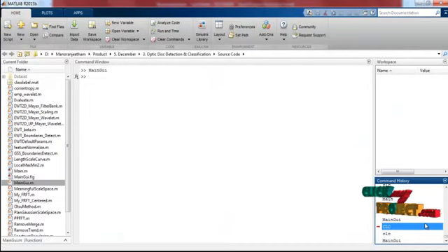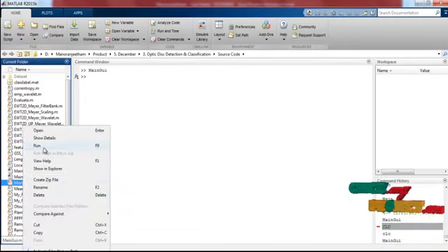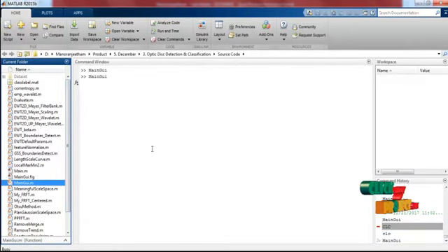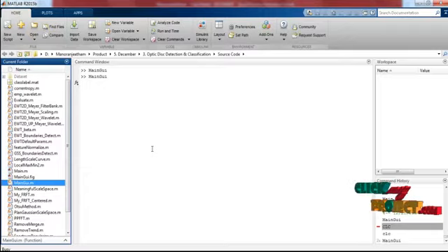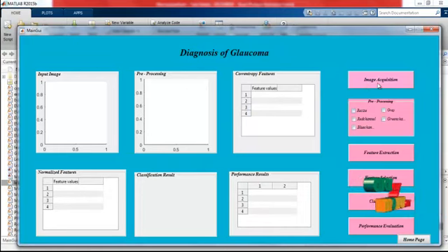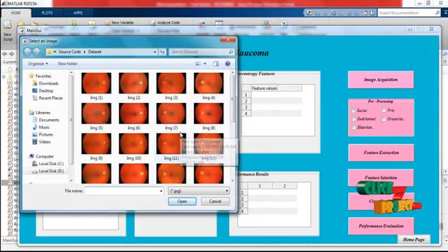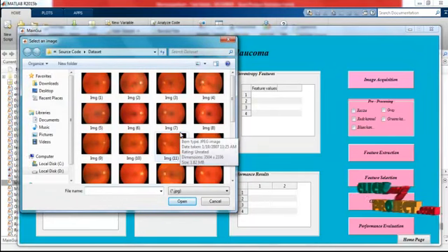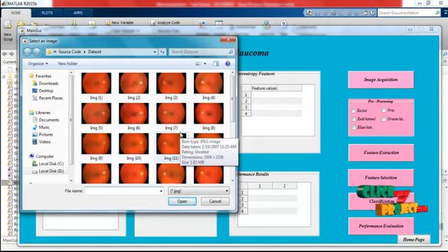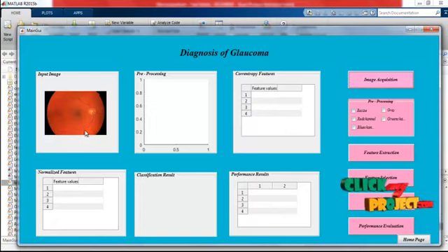Now we are going to see the running procedure of the project. To run this project, right-click on the mainkai.m file. The main GUI figure will appear, and we process step by step. First, clicking the image acquisition button opens a dialog box containing the dataset images, which includes both healthy and glaucoma-affected eye optic disc images. An image is selected and the input image is displayed.